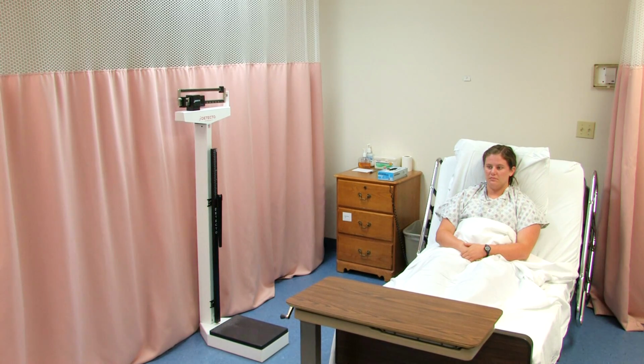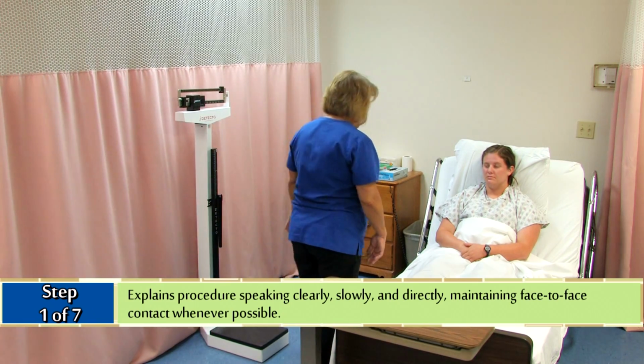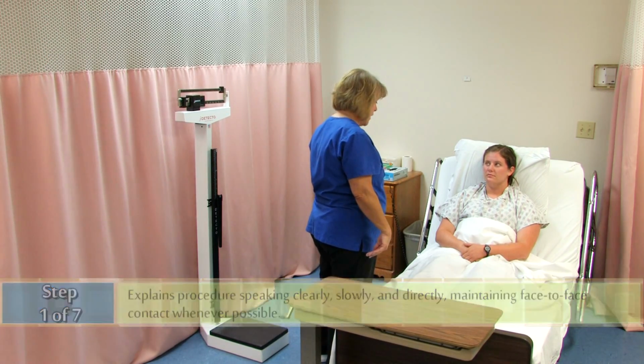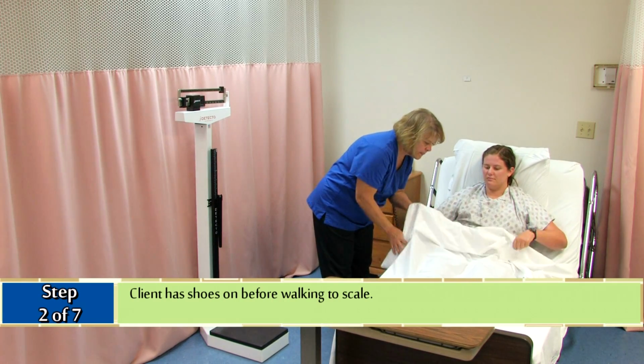Measures and records weight of ambulatory client. Step 1. Candidate enters the room and approaches the client, explains the procedure, speaking slowly, clearly, and directly, maintaining face-to-face contact whenever possible. Step 2. Client has shoes on before walking to scale.